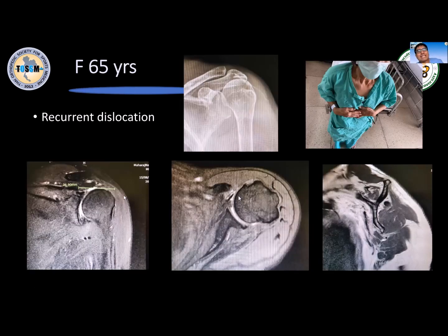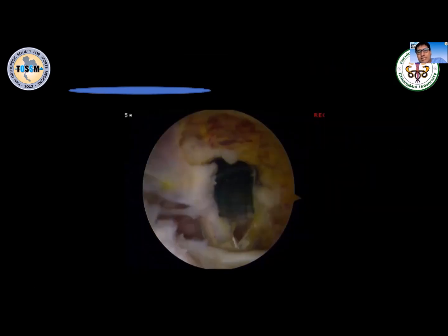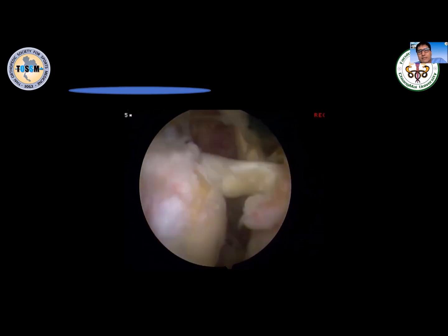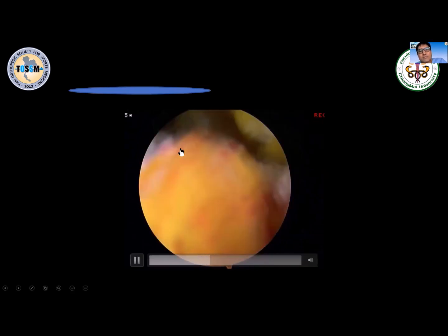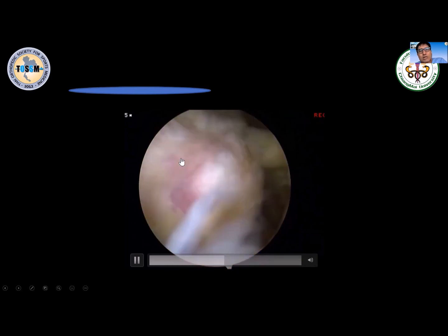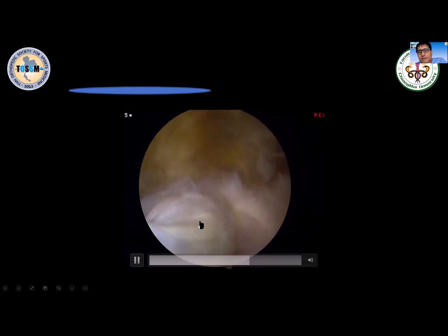I showed her the last case. This is a lady with recurrent dislocation. But she won't hit going up like that. And just a torn subscapularis, supraspinatus, and infraspinatus. Her subscap is barely torn. You can't really see anything much right there. In the front part, right there, you can't see the subscap. And the supraspinatus is completely gone. This is the infraspinatus, somewhat left there.